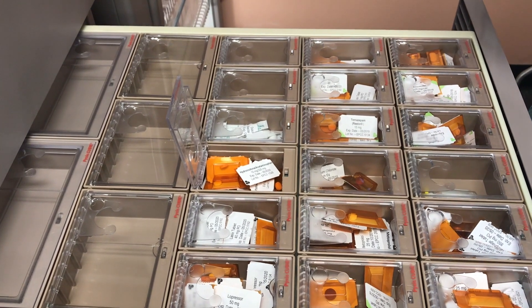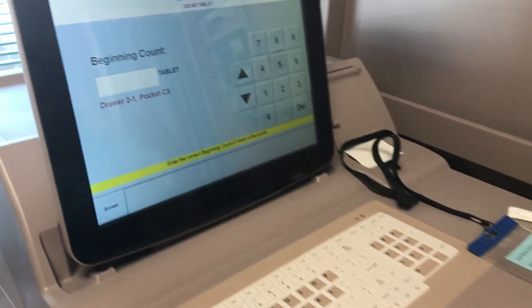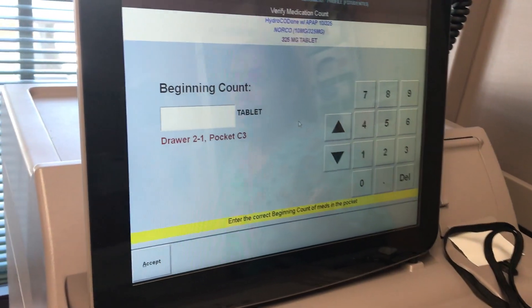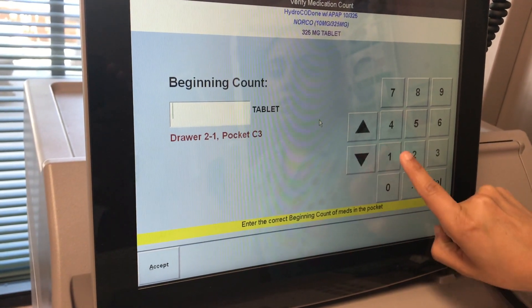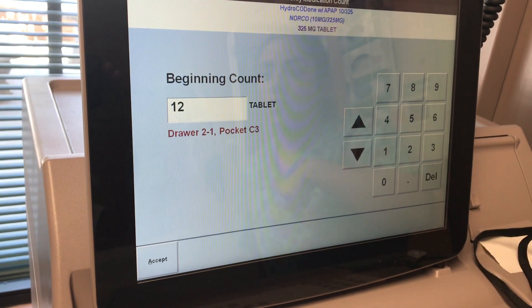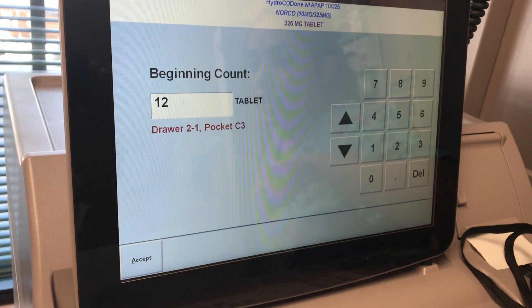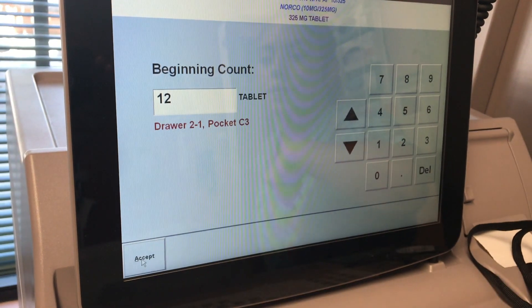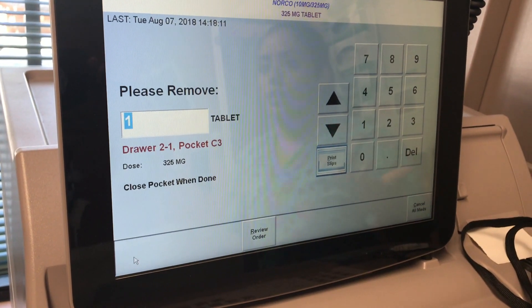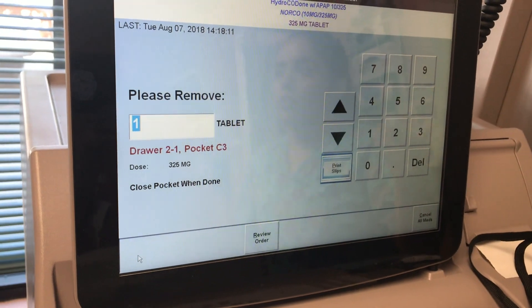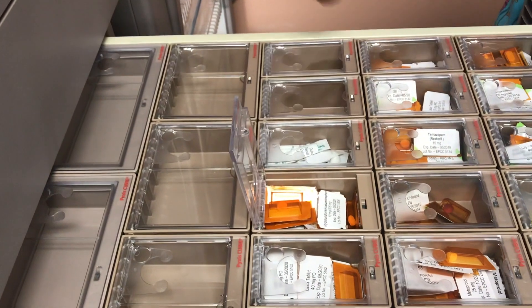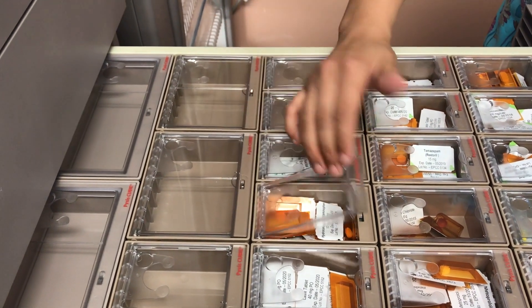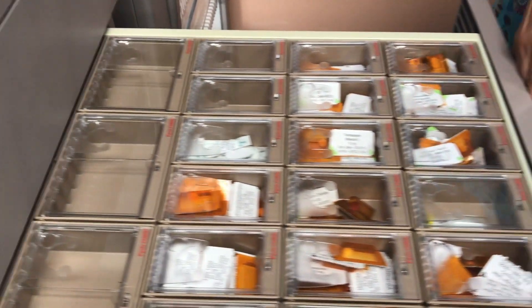Since this medication is a narcotic, it does ask me for a beginning count. The beginning count, once I count them, is 12. So I am going to enter 12 tablets. I am going to click Accept. At this time it instructs me to remove the appropriate number of tablets ordered. So I am going to remove one. I am going to close the pocket and close the drawer.